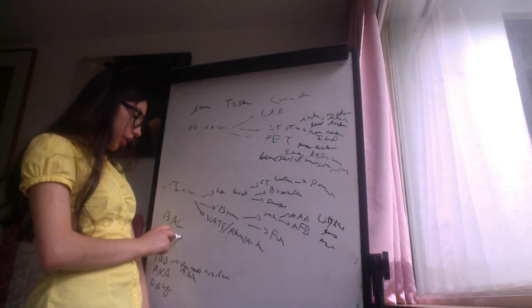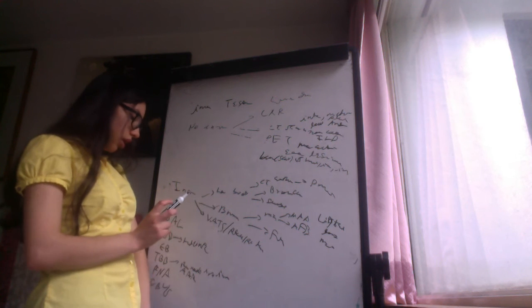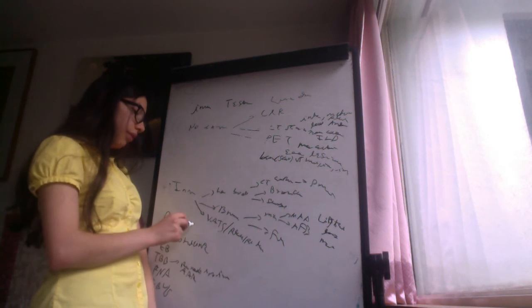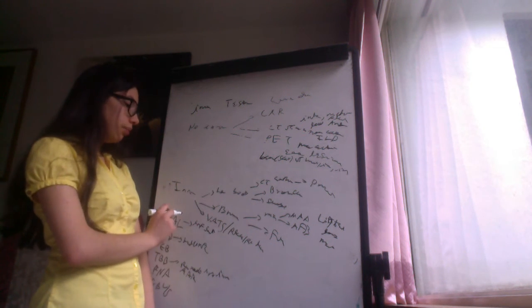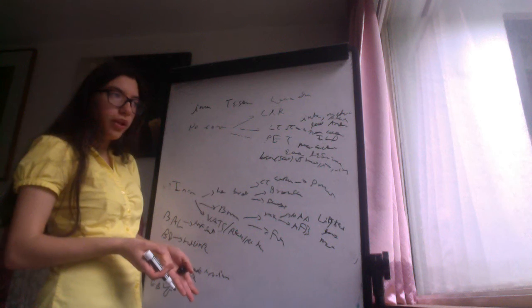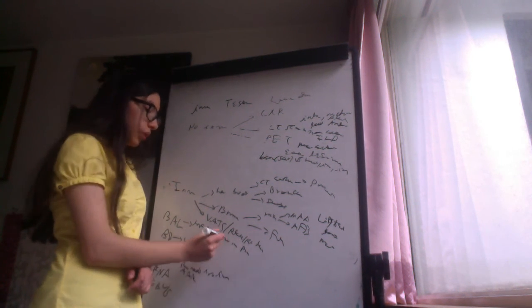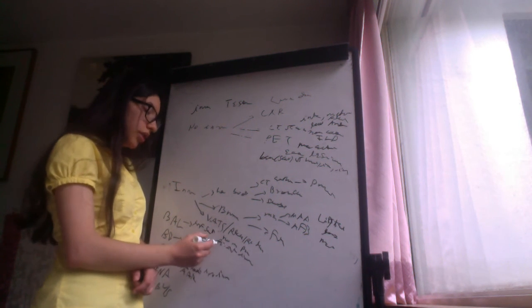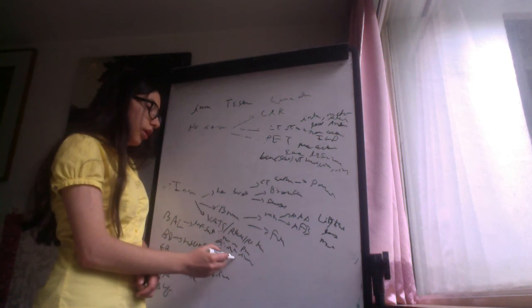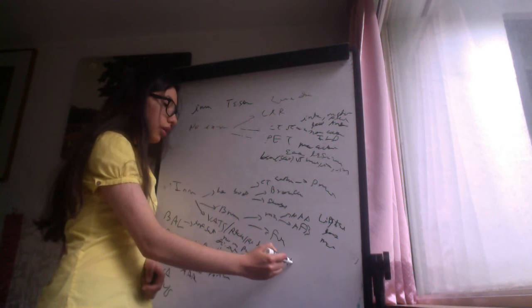The bronchial brushing is to assess malignancy and infections, usually. For bronchoalveolar lavage, after doing an infusion of saline through the tube, we collect the lavage, and indications include non-resolving pneumonia, diffuse infiltrations in immunocompromised patients, diffuse non-infectious diseases of the lung, and suspected alveolar hemorrhage.